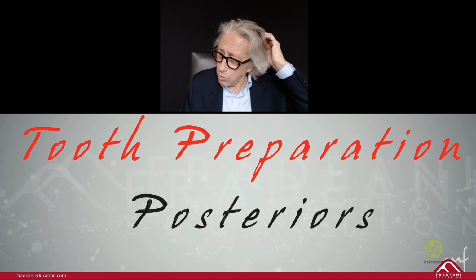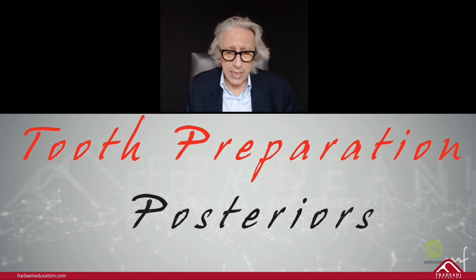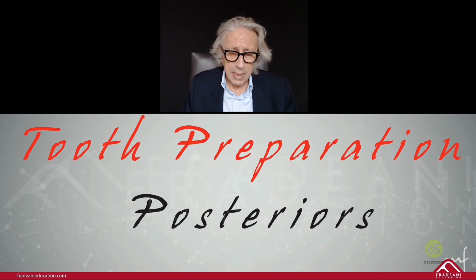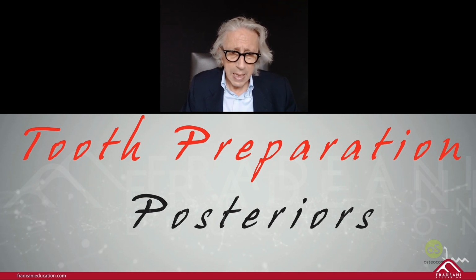we started to do the posterior areas, keeping the anterior in place. So we keep the mock-up of anteriors in place, and we start to prepare the posterior teeth only to be finalized. At the end of the first phase, we will have all the teeth prepared on posteriors, and then the restorations finalized on posterior, keeping the anterior relationship in mock-up, still in mock-up.